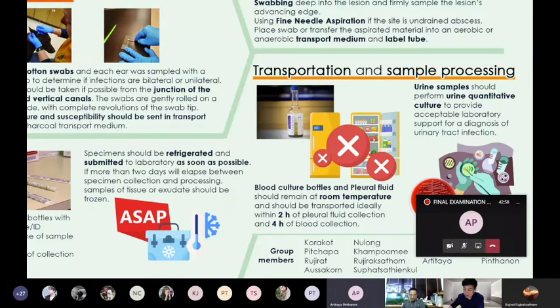For the blood sample and urine sample, bacterial culture should be performed to provide the diagnosis of bloodstream infection and urinary tract infection, and to select the proper antimicrobial for appropriate treatment.